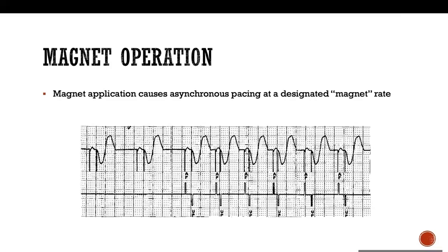So if this patient is pacing dependent, for example, after aortic valve surgery has some sort of AV block, and has a CRT-D, you need the magnet to disable therapy, but you need something to make him pace asynchronous during the surgery. So unfortunately, the only way to do that is you need the programmer and you need to change the setting to DOO for it to be asynchronous. So magnet for pacemaker is asynchronous pacing and magnet for ICD is disabled therapy. So that's the difference between both of them.